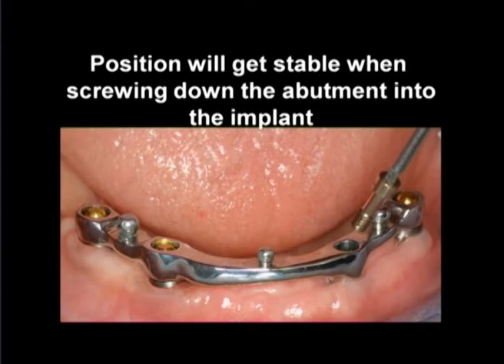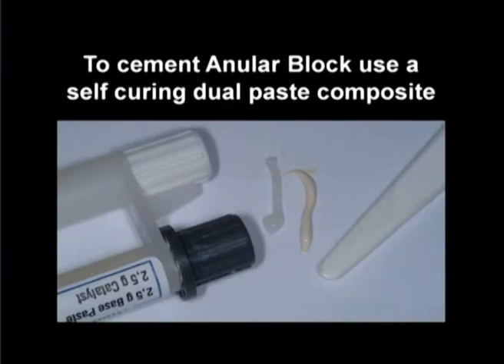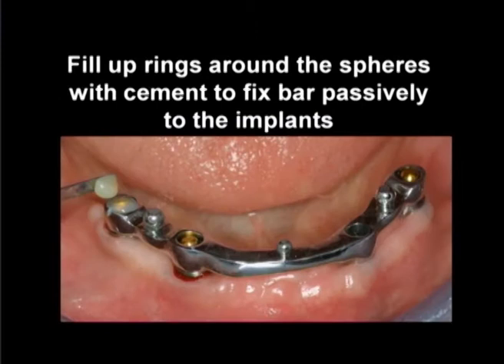Carefully check on the annular block's connections. Rings must fit on the spheres passively. No connection of any type has to be detected. Otherwise, grind around the rings or the titanium of the attachment if necessary. Check out presence of passive position. Fill rings with self-curing composite cement.